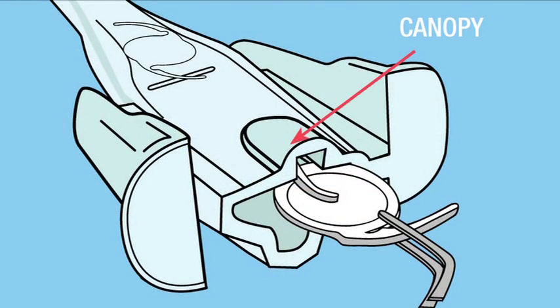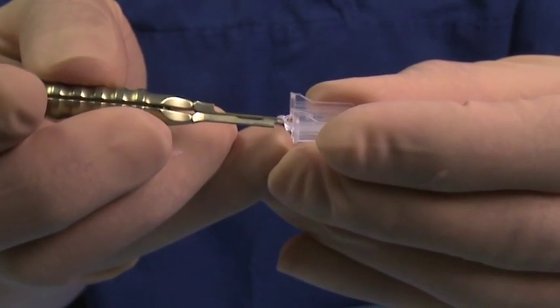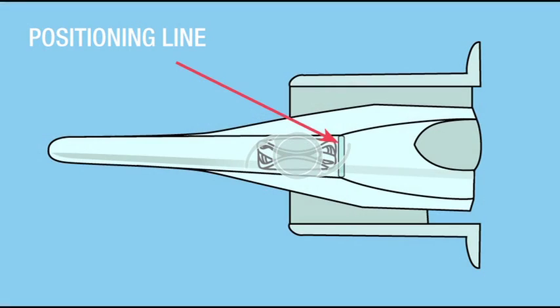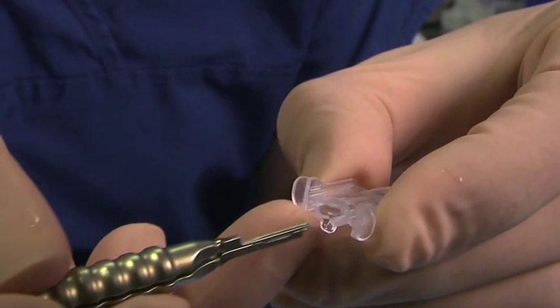Ensure that the lead haptic is fully tucked over the optic body. Grasp the trailing haptic and tuck it over the optic body. Advance the lens past the line marked on the cartridge. Ensure that the lens and haptics remain folded in place after removing your forceps.